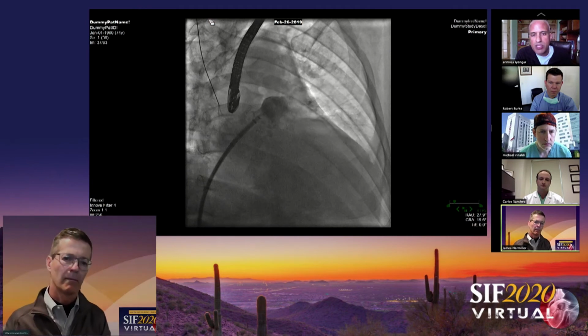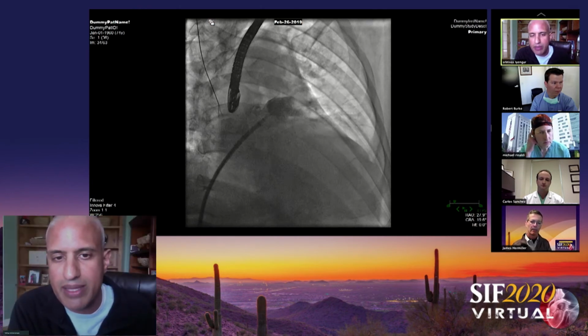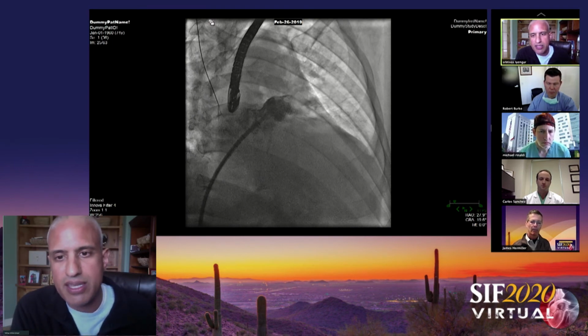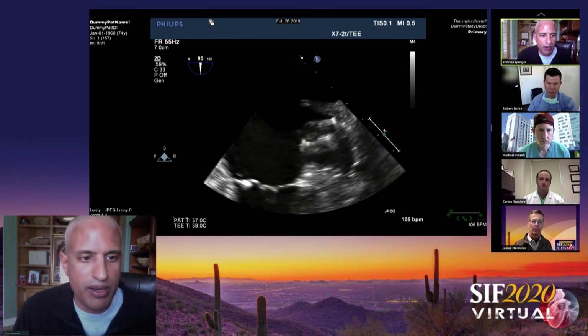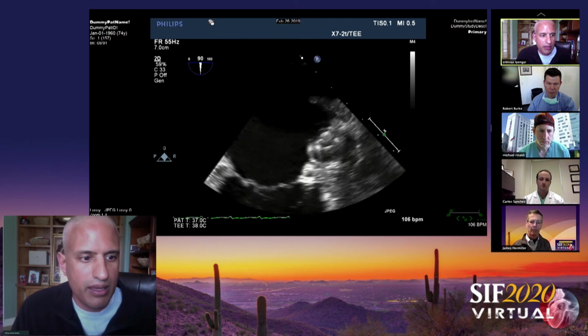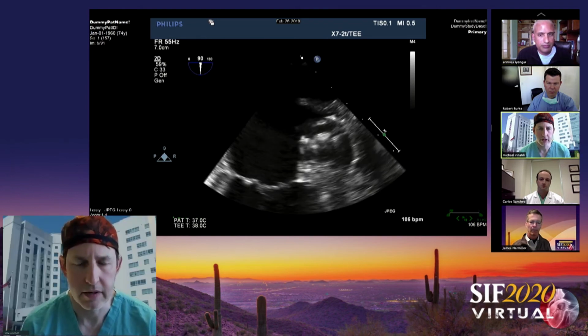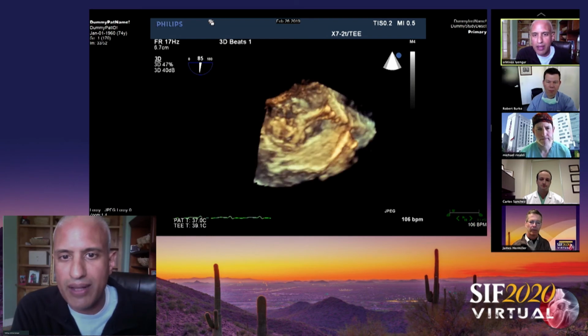And what this was is from a very proximal, less torque on the sheath deployment. And in the next shot, you can see the T obviously looks a much happier placement of where it is across the ostium. And let's see here. So the feet really expanded. Right. And when I pull back, here's your 3D view of it as well.